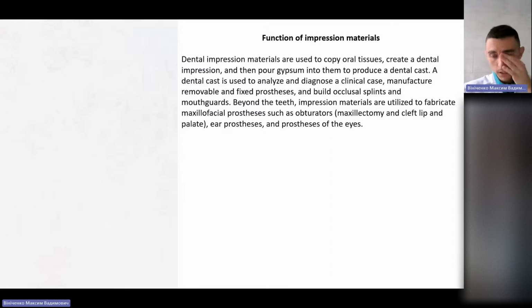Another example: if the patient has a narrow dental arch of the maxilla, and we want to use, for example, Damon Q brackets, which have a very wide wire. For example, the width of this wire would be this. So we understand that we could not tip the lower incisors onto the lower molars. We could not tip them.